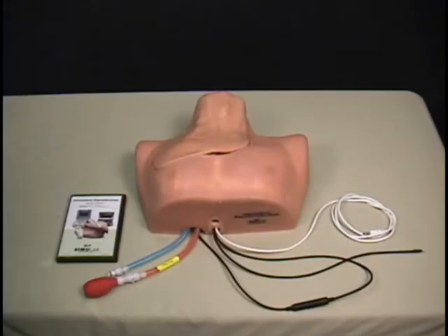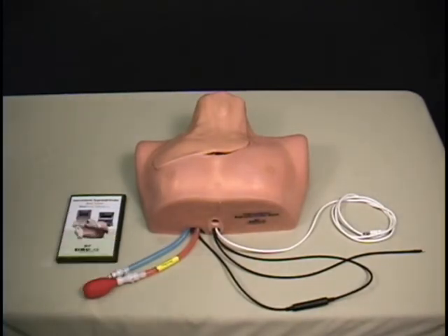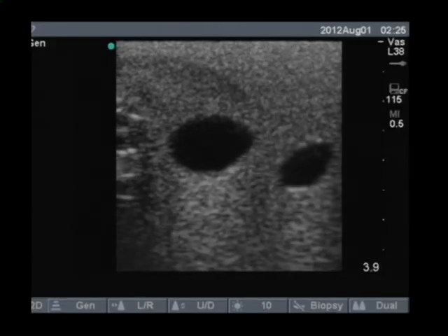The trainer's two vessels also come pre-filled with fluid. The vein is blue and the artery is red. By attaching the pulse bulb to the artery, a pulse can be created that is palpable externally and is visible under ultrasound.